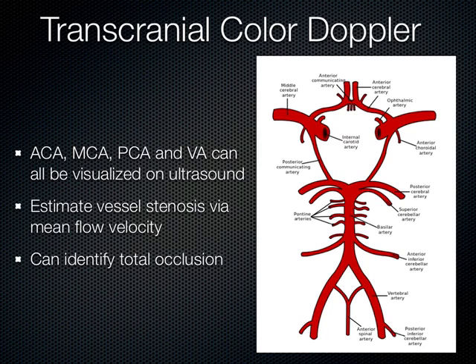And when there's a blockage, or a narrowing of the artery, or stenosis, we see the flow velocities really jump up using the Doppler. We can measure the velocities, and we see the mean flow velocity really jump through the ceiling when there's stenosis. So that's kind of what you're looking for. And you can also identify where there's been a total occlusion.